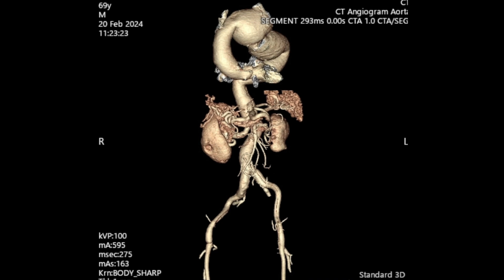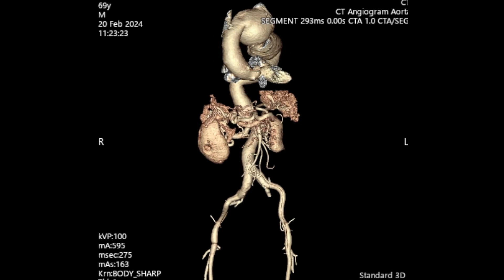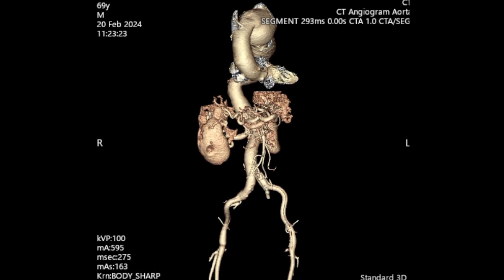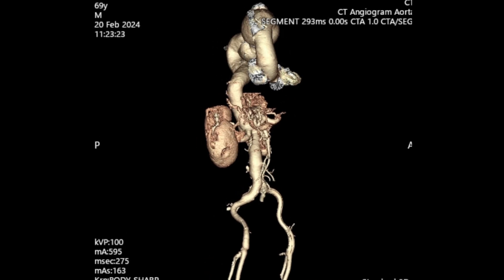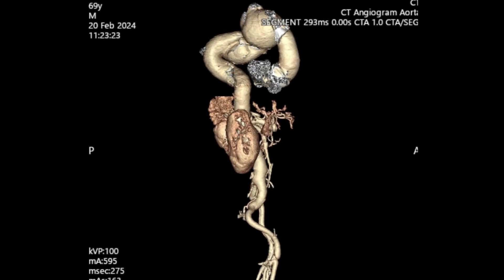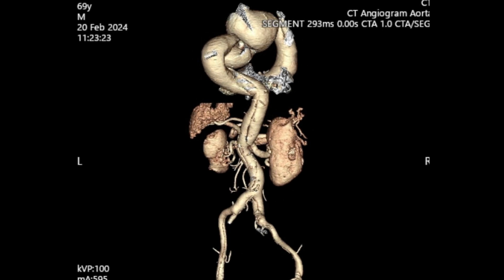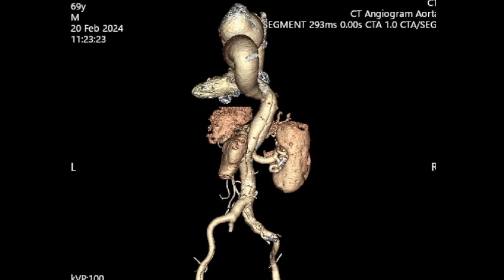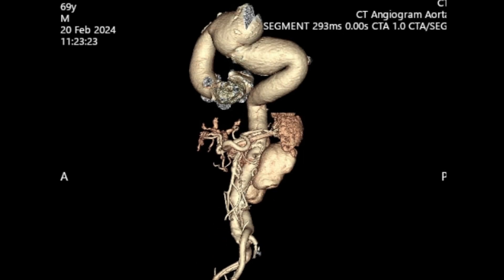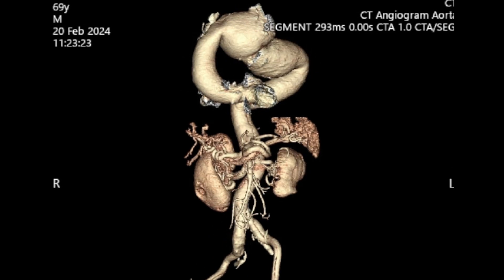This will isolate the proximal descending and distal arch segment of the aortic aneurysm. Once we resect the aneurysm, I'll place an interposition graft from the mid arch — zone 1 level — down to the distal descending aorta, while ligating the left subclavian artery from inside the aneurysm. Hopefully, we'll get this patient out of immediate trouble.